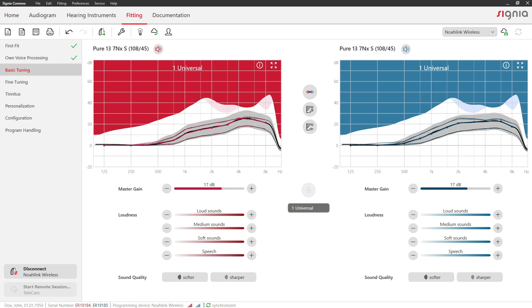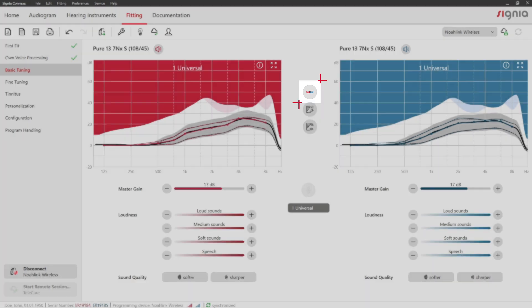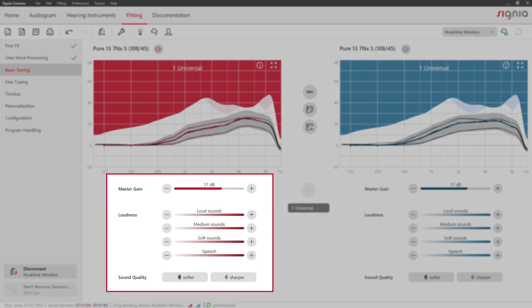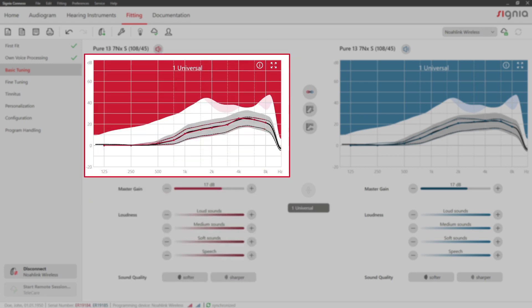First, check if the hearing aids are coupled and change it if necessary. You can easily adjust master gain, loudness, and sound quality according to your client's sound impressions. The changes are reflected in the gain curves.